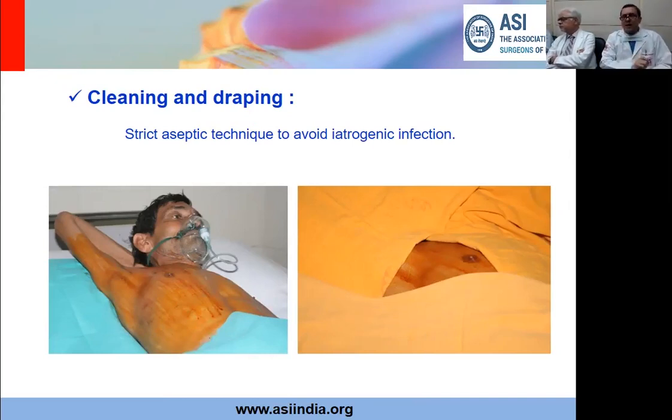Now, many times, friends, I have seen just one towel being put on the inferior side, and then superiorly, medially, laterally, everything is exposed. There's no way you can avoid your gloves touching the unsterile area and you end up breaching the asepsis. That's not correct. That's not the right way.